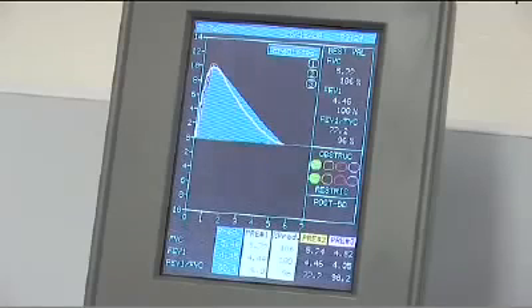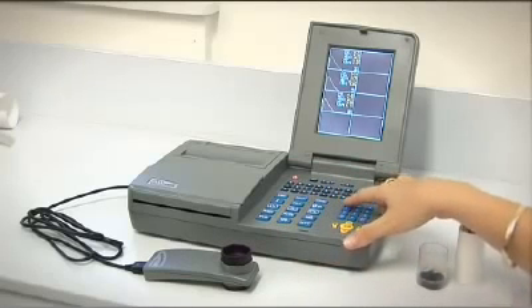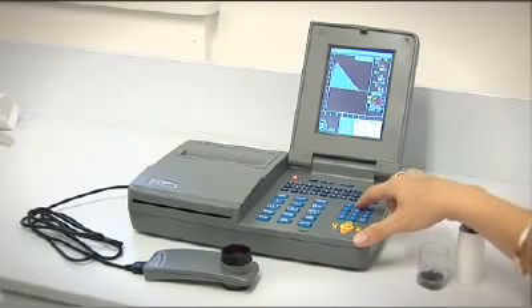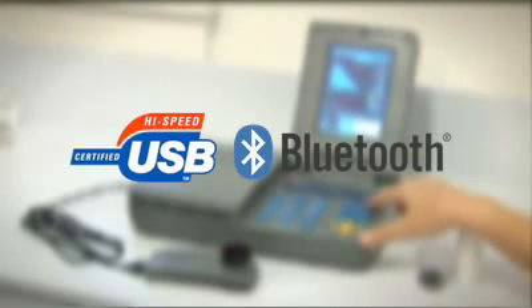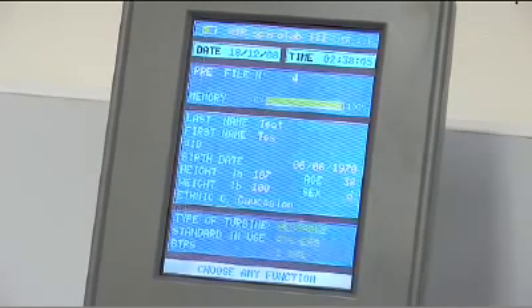Your MIR SpiroLab 3 has a high-resolution colour screen and internal battery that makes it suitable to operate independently as a mobile device, with a 6000 test memory and an internal printer. It can also operate in a paperless office environment with USB and Bluetooth networking capability. The SpiroLab 3 comes with medical director compatible management software.